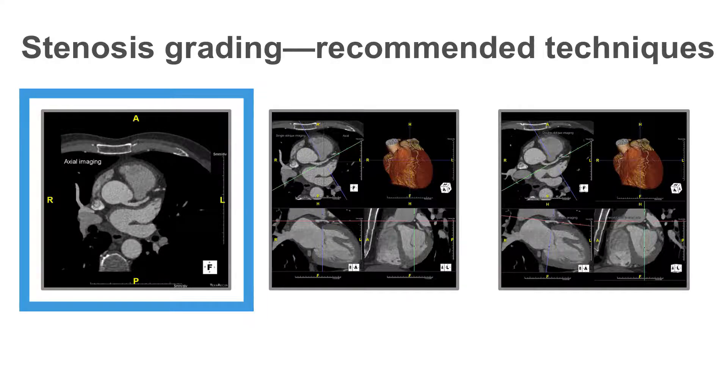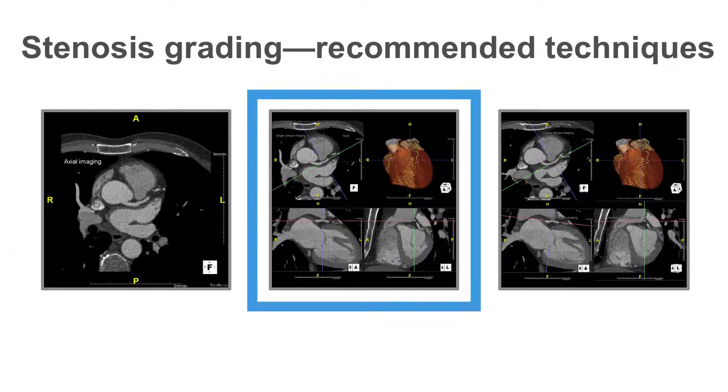This can be seen on the left hand imaging pane. Single oblique imaging is where the crosses are aligned with the plaque in one plane only, with the reader looking at all of the corresponding images thereafter. This is seen in the middle imaging pane.